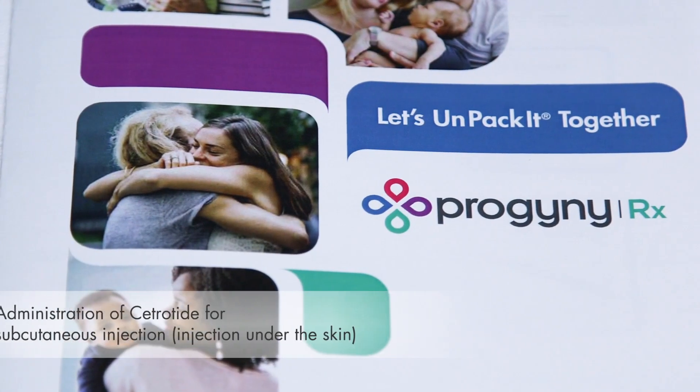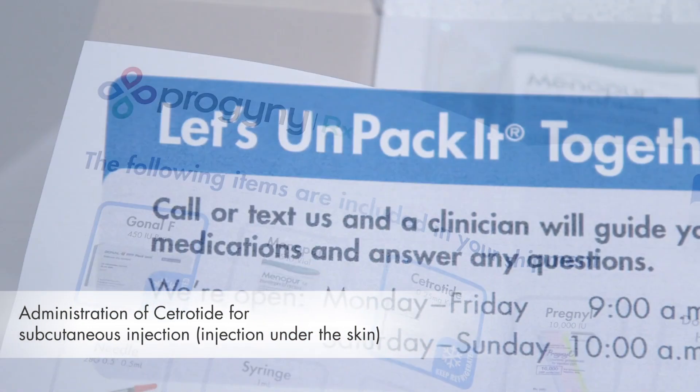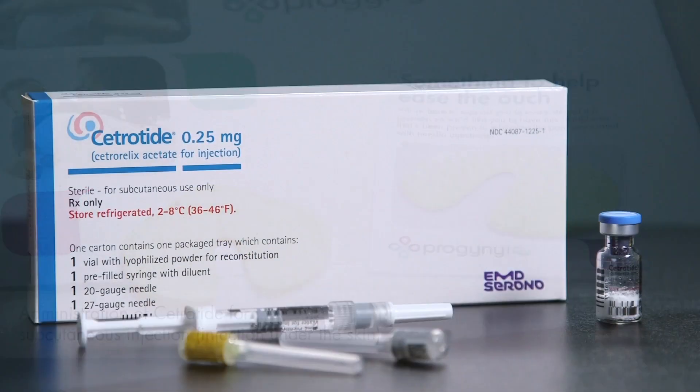Welcome to the Progeny Rx Medication Administration video series. My name is Hannah. I'm a nurse at VFP Pharmacy, a Progeny Rx Pharmacy partner. In this video, we'll discuss how to mix and administer Cetrotide.